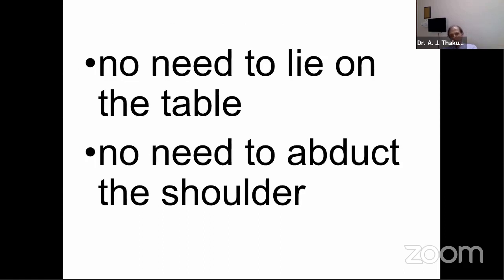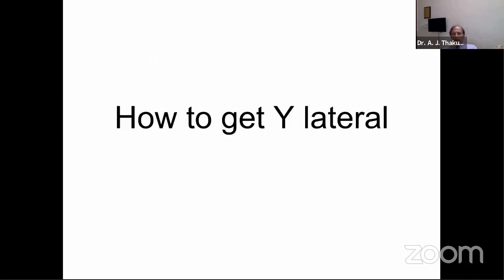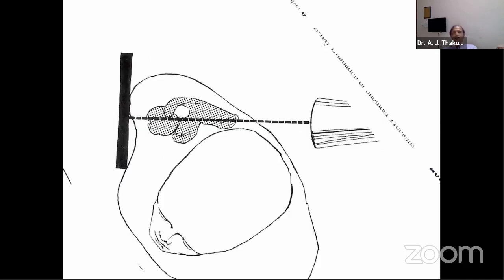But there is another way of taking a perfect lateral. There is no need to lie on the table. No need to abduct the shoulder. The view we call a Y lateral. Now, how to get that Y lateral is to place the patient along the long axis of the scapula. Then we get the perfect lateral.